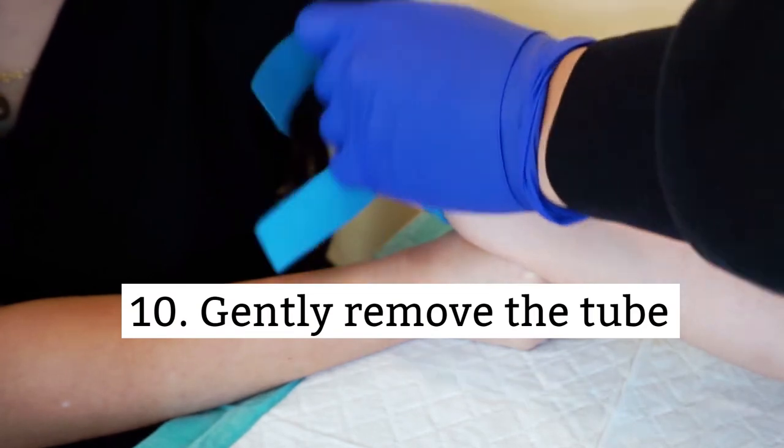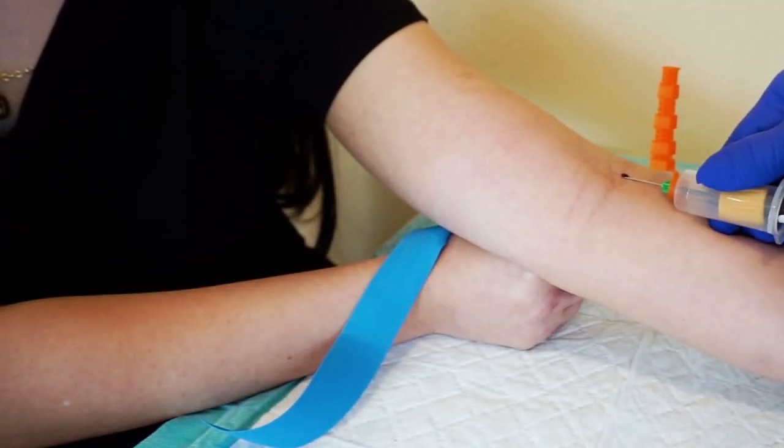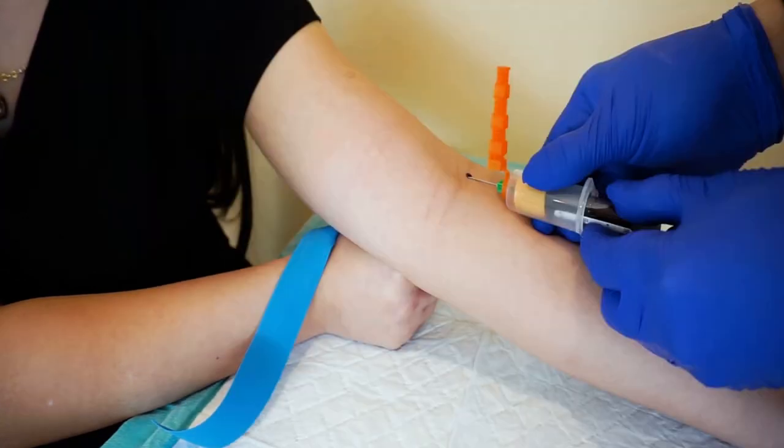Ten, wait for the blood to fill up the tube, then gently remove the tube. Hold the hub steady with two fingers while using the other three fingers to remove the tube. This is to prevent the needle from pulling out as you are removing the tube.